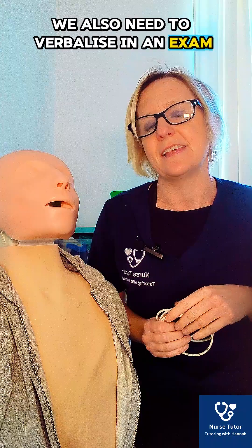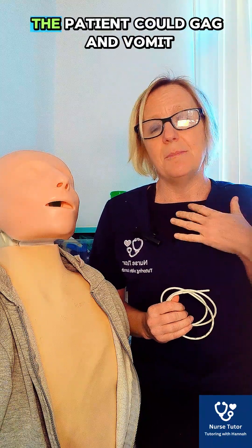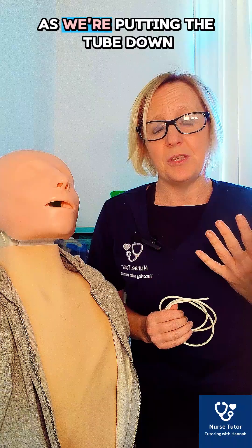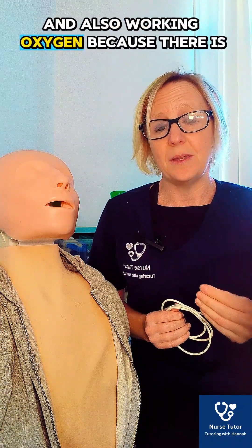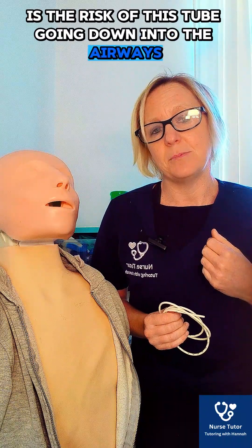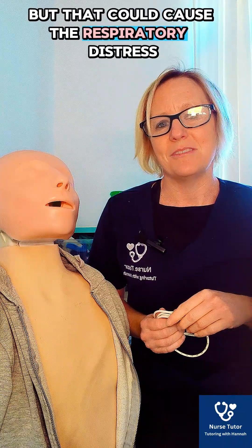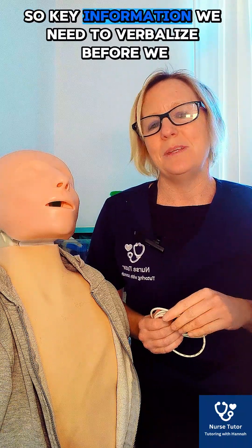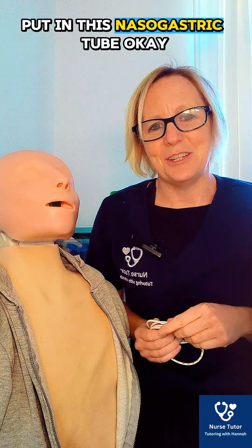We also need to verbalise, both in our exam and in clinical practice, that we should have available working suction. The patient could gag and vomit as we're putting the tube down, so we'd want to make sure we can clear the airway if needed. We also need working oxygen, because there is the risk of the tube going into the airways during insertion, which could cause respiratory distress.